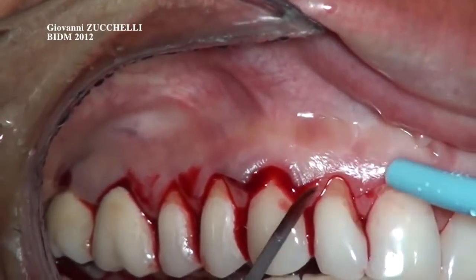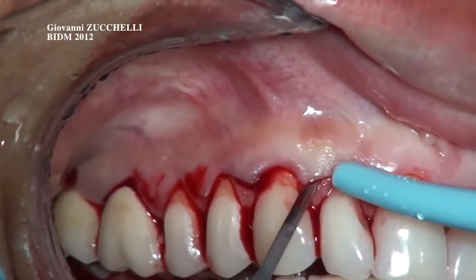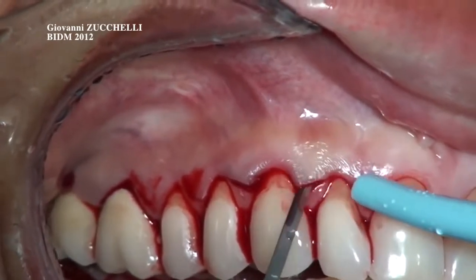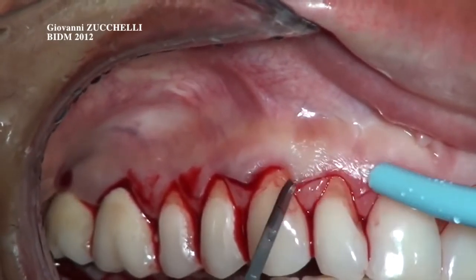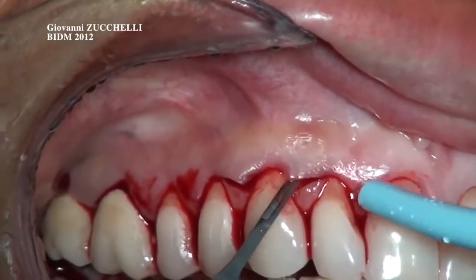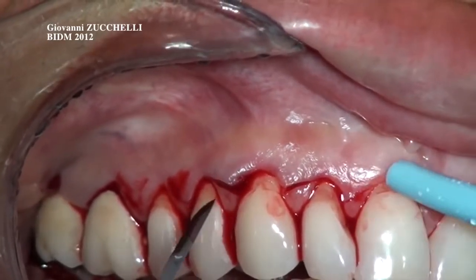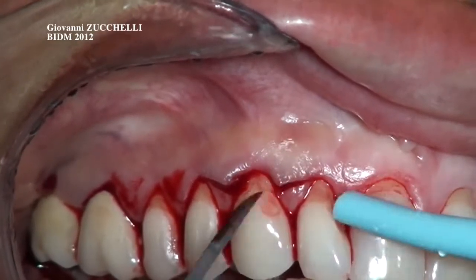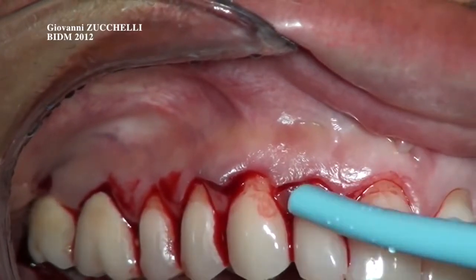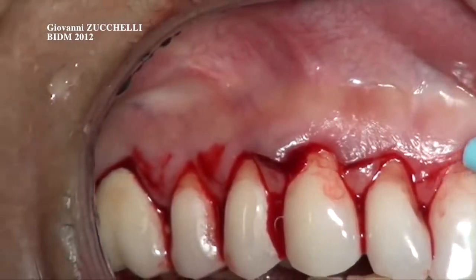Once the tip of this papilla is above your knife, it's possible to go parallel to the soft tissue and elevate the second surgical papilla. You can see that when I elevate one and the second surgical papilla, there is enough mobility for the keratinized tissue to be elevated even without the need to put the knife inside it.